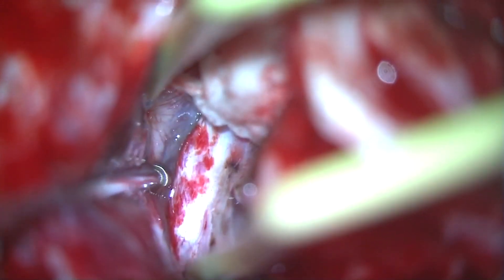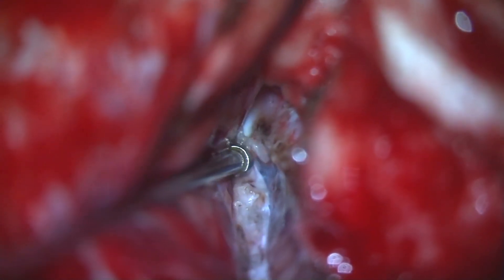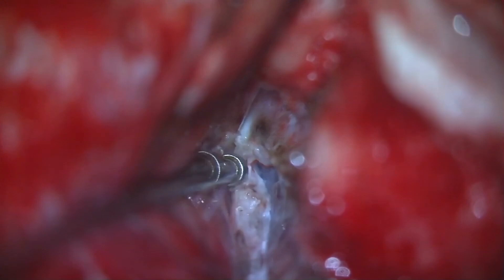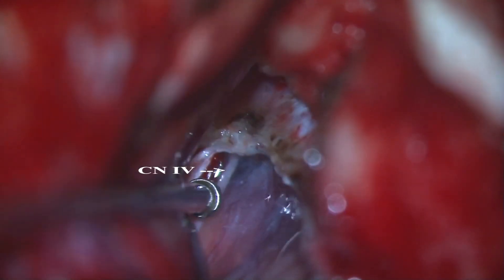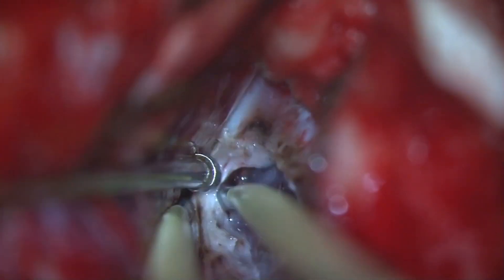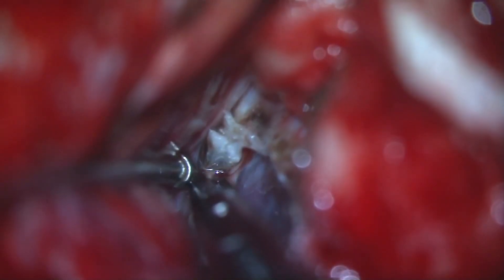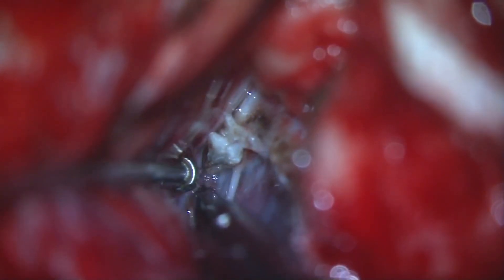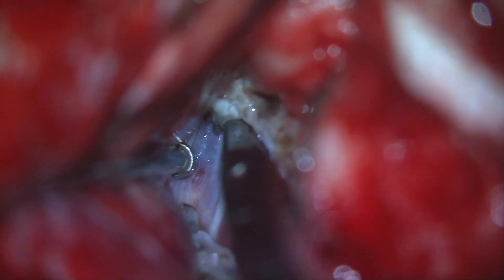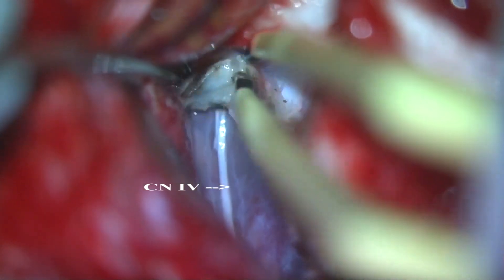Progressively, the tentorium is cut, highlighting the posterior subtemporal pathway. As the tentorium incision approaches the incisura, the fourth nerve must be identified to allow the final cut to be safely performed. Preservation of the fourth nerve is confirmed.